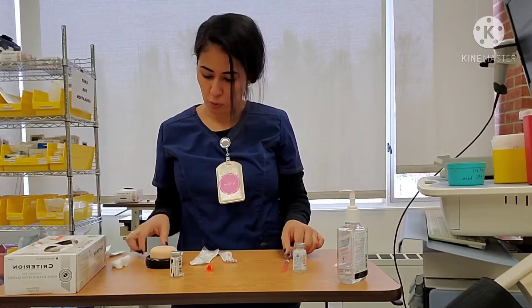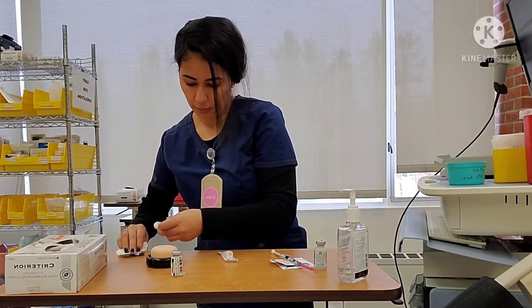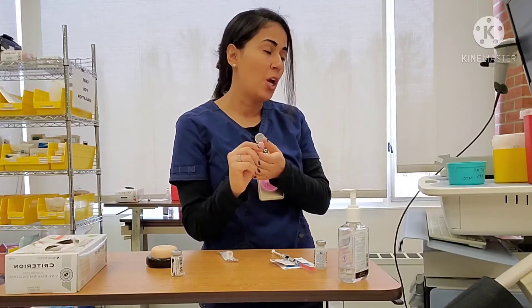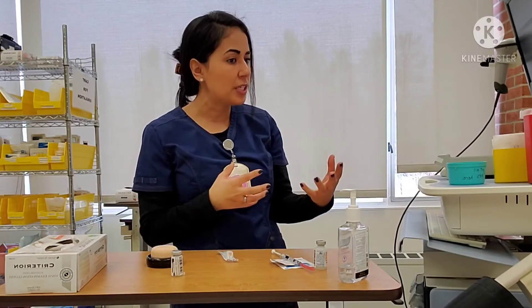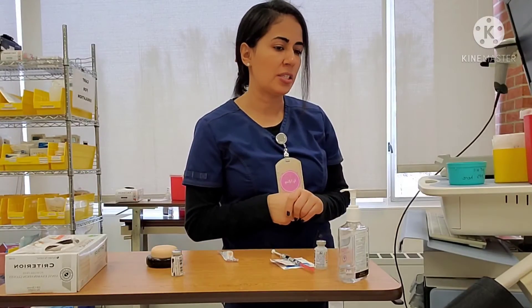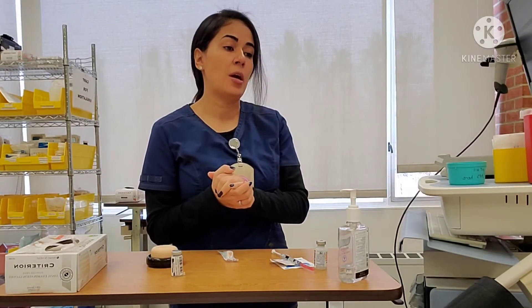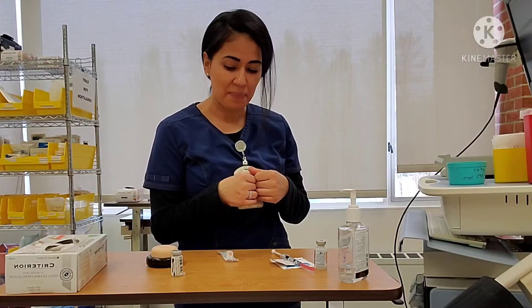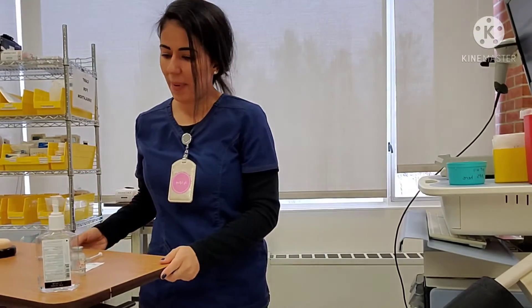I have my alcohol, gauze, and medication to scan. Hi, I'm back again. The provider has ordered heparin, which is a blood thinner — an anticoagulant medication. We use it to help prevent blood clots since you're not moving as much as usual while in the hospital, making you prone to blood clots. It'll be a subcutaneous injection and it goes in the abdomen. If you notice any signs of abnormal bleeding, go ahead and ring the call bell and let me know. Also, try to move as much as you can — move your feet and legs, maybe march your legs in the bed.